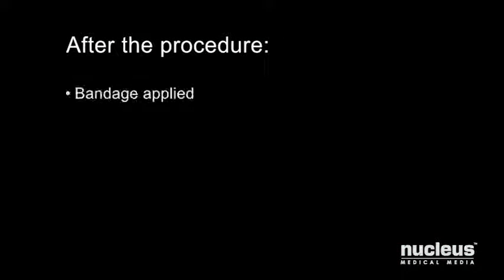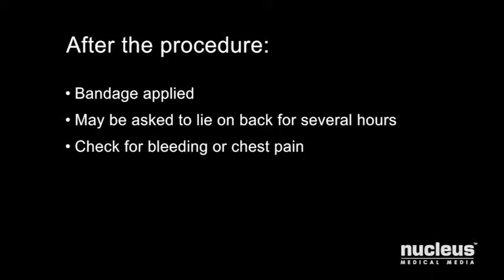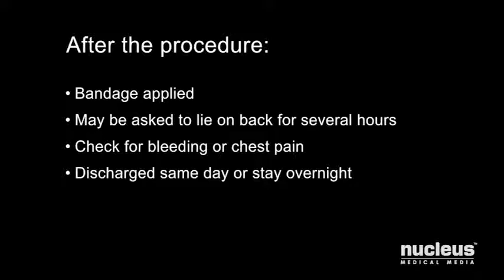After your procedure, a bandage will be applied over the artery that the doctor used to get up to your heart. You may be asked to lie on your back for several hours, during which time you will be checked periodically for any signs of bleeding or chest pain. You may be discharged home on the same day or after an overnight stay in the hospital.